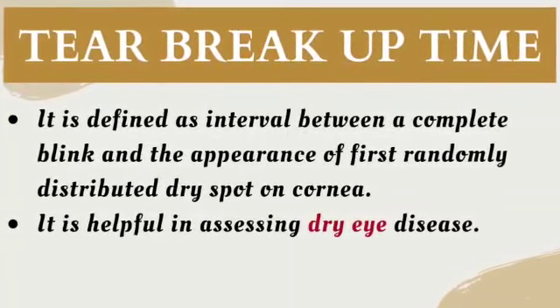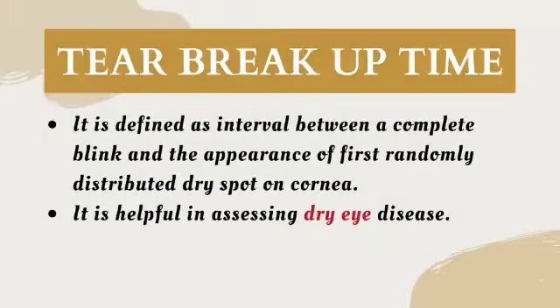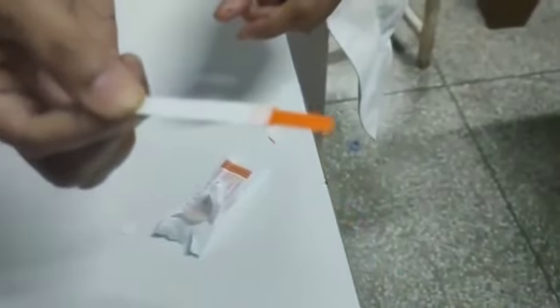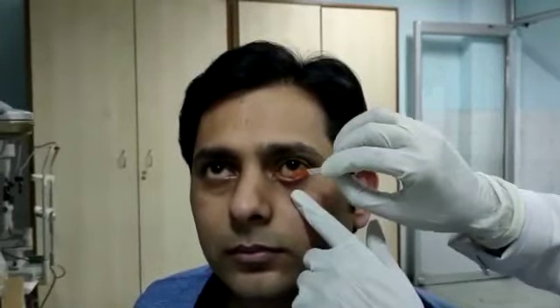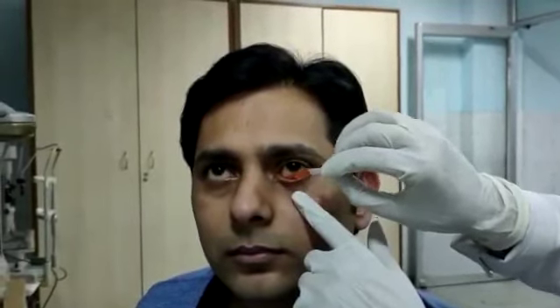Before performing this test, we have already explained to the patient about this procedure. First of all, unwrap the fluorescein strip. Make sure not to touch the orange tip. We will put one drop of normal saline on this strip. Then this fluorescein strip is instilled into the inferior fornix of the patient.